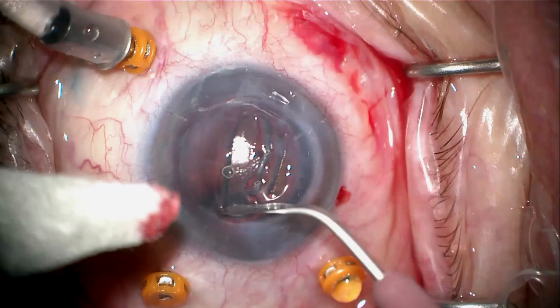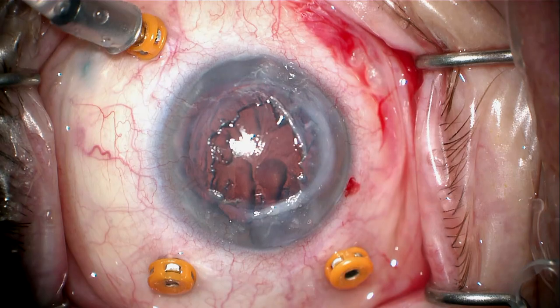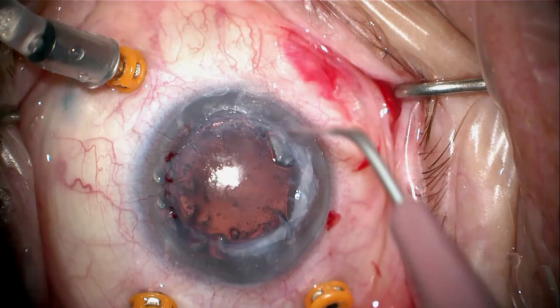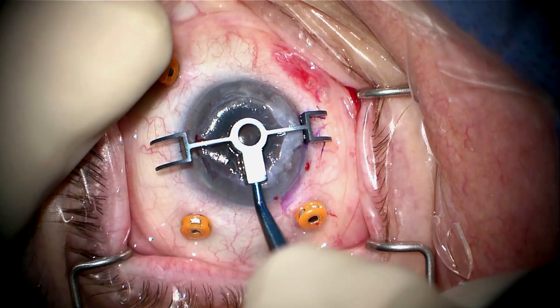Now we're going to scrape the cornea and remove the epithelium to give myself a better view. I could have done this earlier in the procedure, but I thought my view was good enough. For the YAMANI portion of the procedure, I really want to maximize my view.